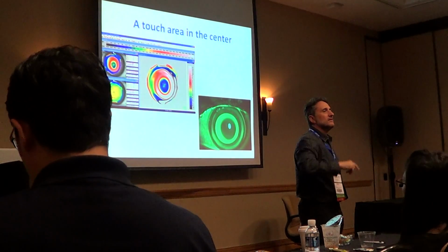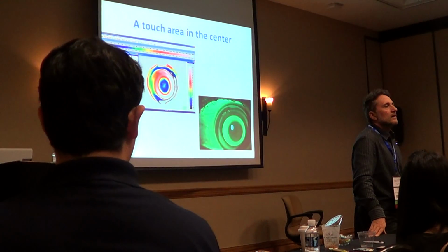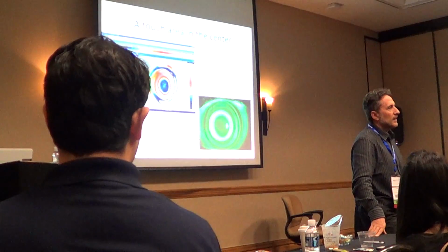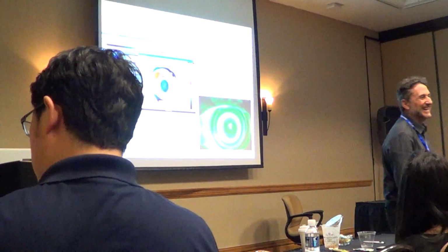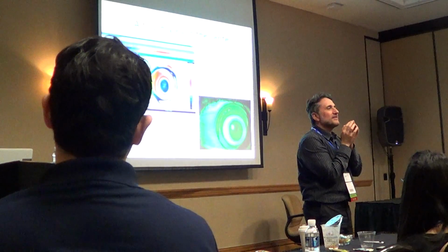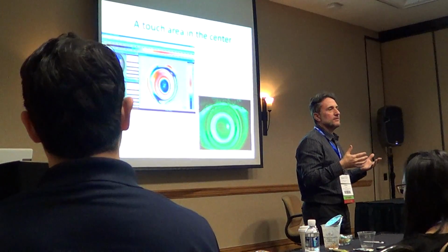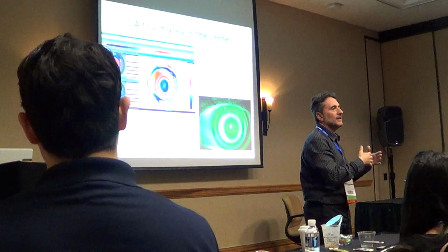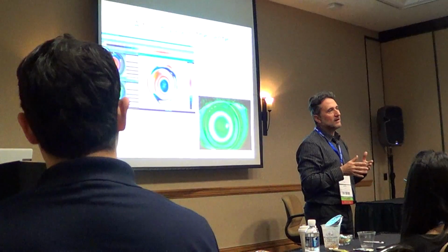Okay? Sorry, the question? So, from what you're saying, from your experience, over 50% of central islands can be fixed by increasing the sagittal depth. Yeah, in my humble opinion, 100% of central islands. No, 99%. Okay, this is a tough point because books say the opposite of what I say. So the only thing I could tell you is that it's my experience. I solve it this way, and I will show you a picture about that. But try for yourself. It's very easy.